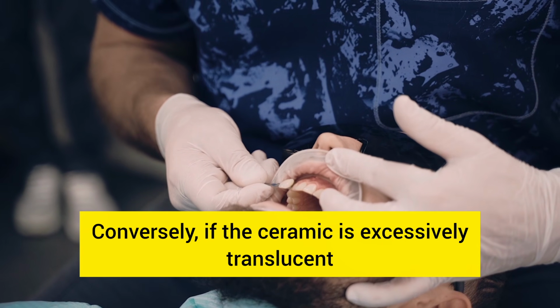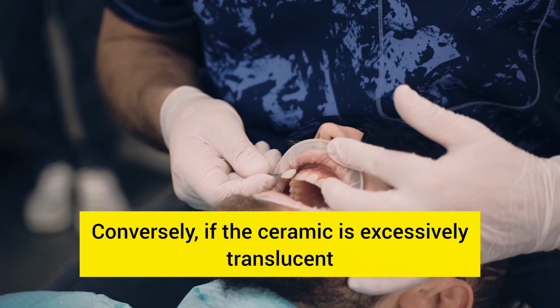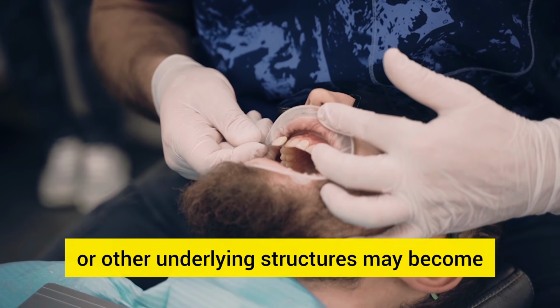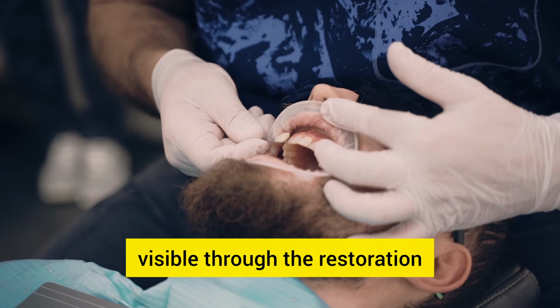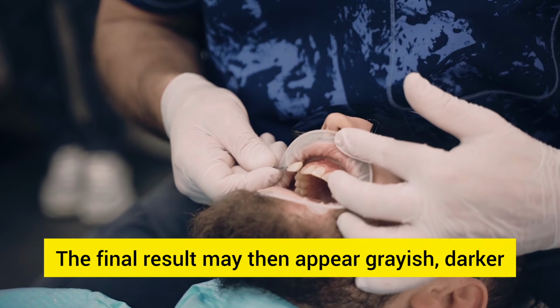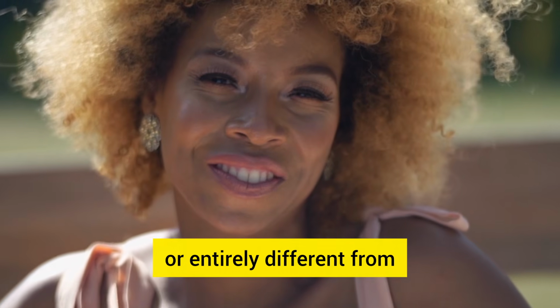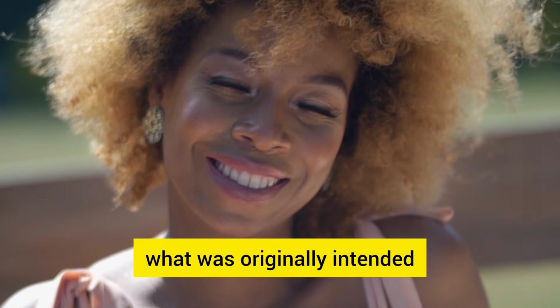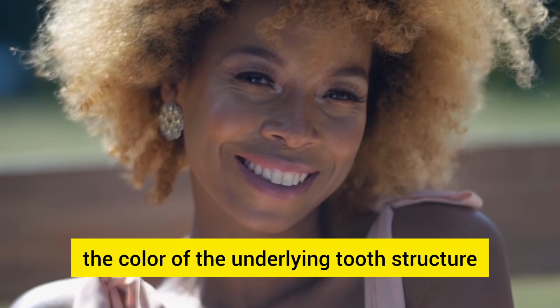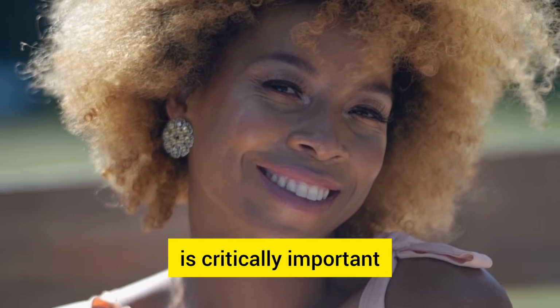Conversely, if the ceramic is excessively translucent, the color of the prepared tooth, core buildup, or other underlying structures may become visible through the restoration. The final result may then appear grayish, darker, or entirely different from what was originally intended. For this reason, the color of the underlying tooth structure is critically important.